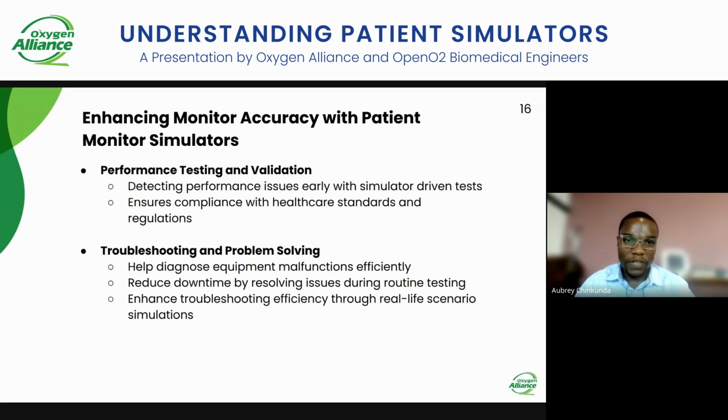As Janet has already mentioned in a part of the presentation, you can simulate various conditions and various scenarios using the patient simulators. So, for example, you can check various ranges when it comes to, let's say, the SpO2 or even the heart rate and other parameters. That way you can test through a vast set of scenarios, and this can make the test very efficient because you cannot miss anything.